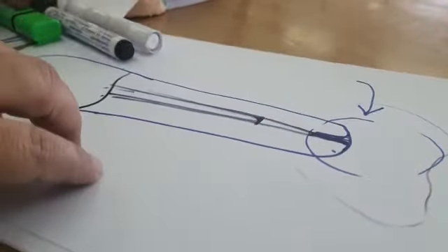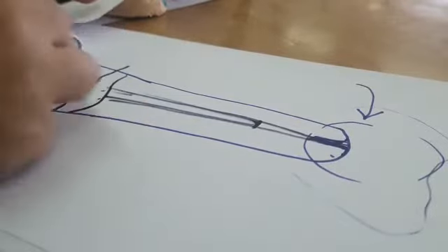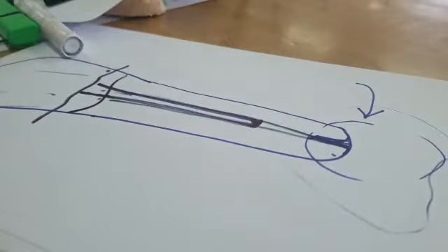Second case, scenario. This is broken. The crown broke. I don't have this. And I have the fiber post here present. How do I take it out? Fiber post? Yes. Drill. Drill. What is your option?